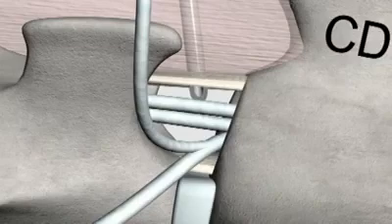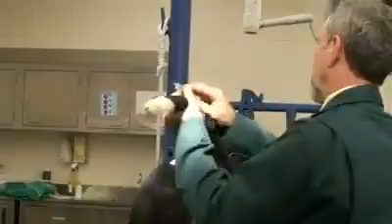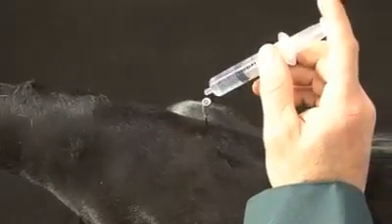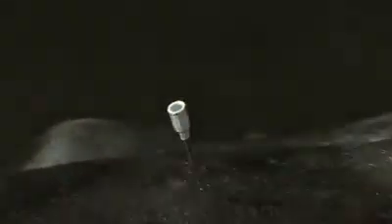You may also hear the faint sound of air rushing into the epidural space as the negative pressure is relieved and the epidural space expands. Many clinicians will confirm proper needle placement by instilling 1 or 2 drops of anesthetic from the syringe into the hub of the needle. If necessary, gently redirect the needle until the fluid disappears.